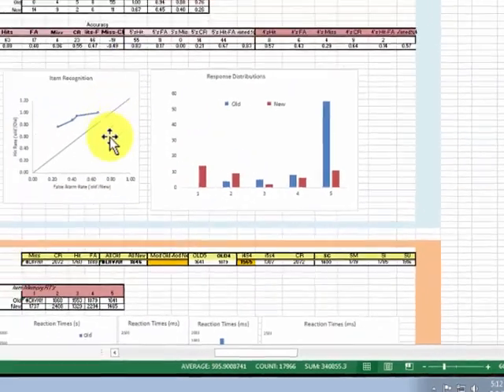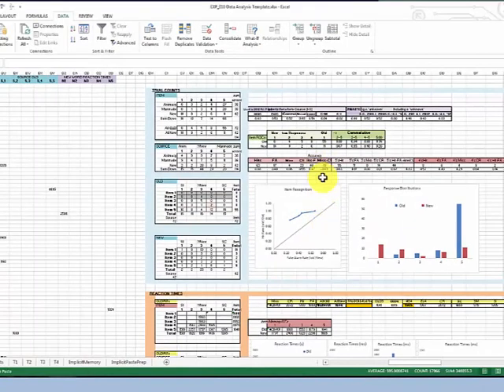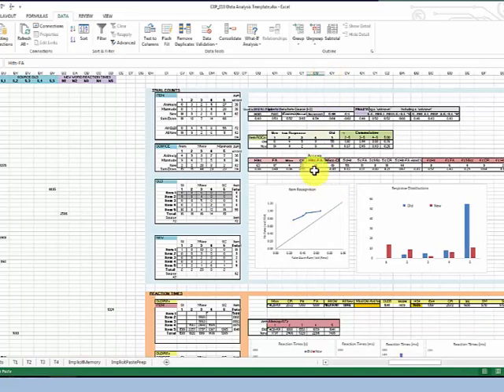Now, one thing you can cue into is performance. In this case, this would be hits minus false alarms, and we can see that that formula is drawing from hits minus false alarms and that proportion thereof, and we see that they performed at about 47%. In this case, chance would be at 0. So you can see they're above this diagonal line of chance in the ROC curve.